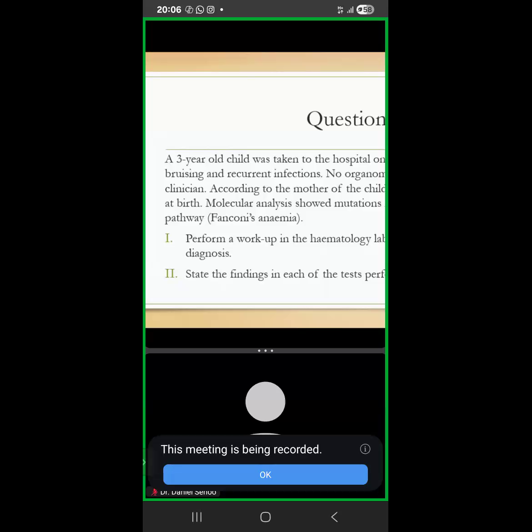But here we are. They have made life very simple for us by telling us of Fanconi's anemia, cytopenia. What do you look at next on the peripheral blood smear? Because of the different differential diagnoses that we have mentioned, aplastic anemia, for example, if you pick aplastic anemia, what happens to the cells?